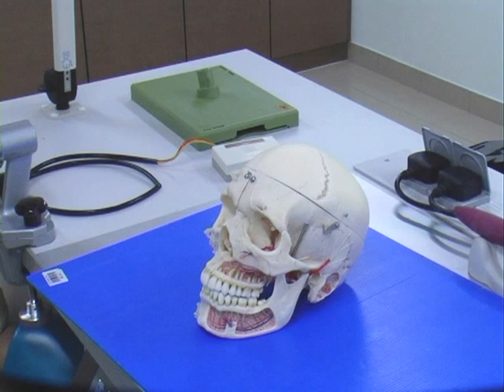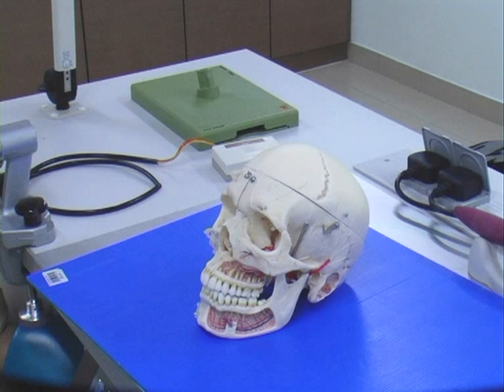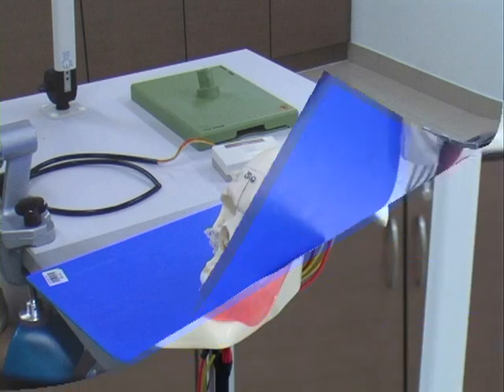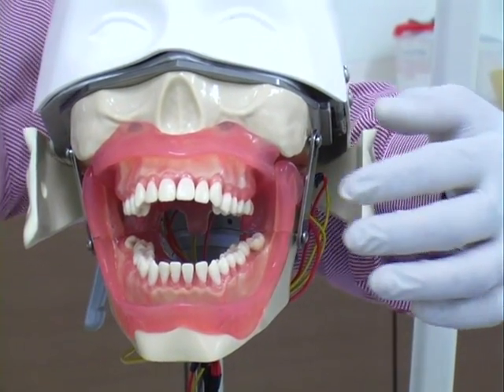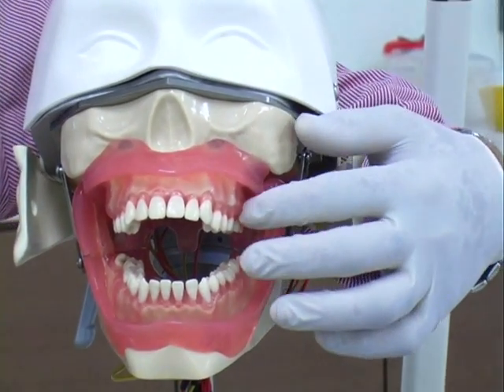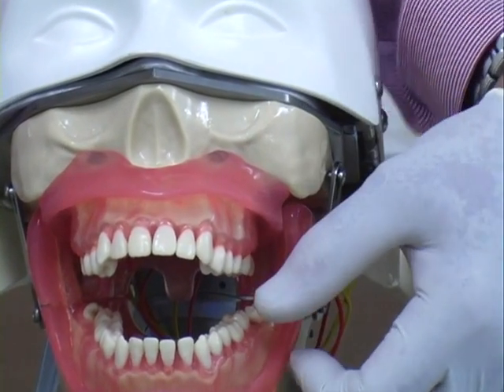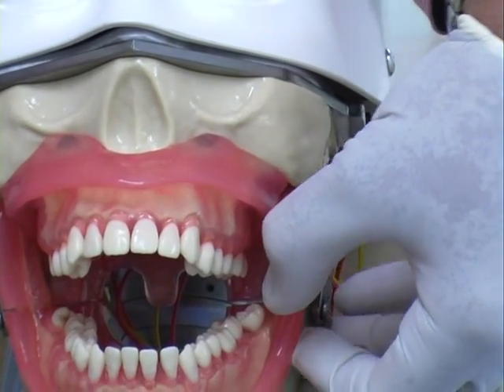We now move to the mannequin model for the administration of inferior alveolar nerve block. This is the mannequin model which we are going to use for administration of inferior alveolar nerve block.